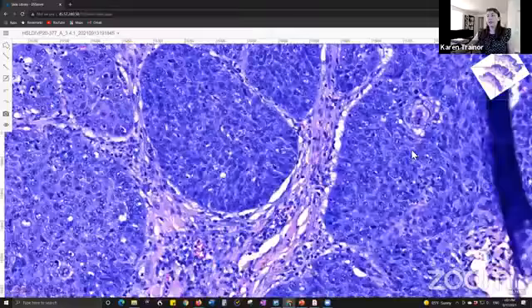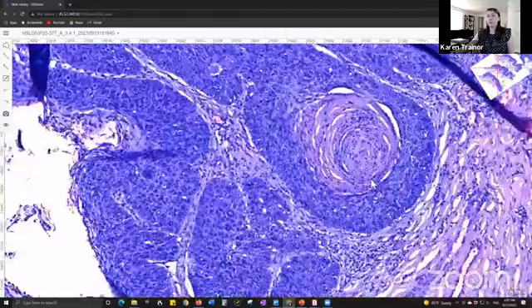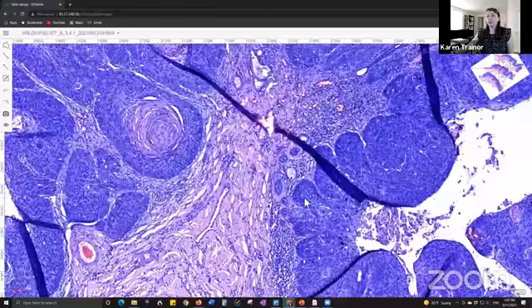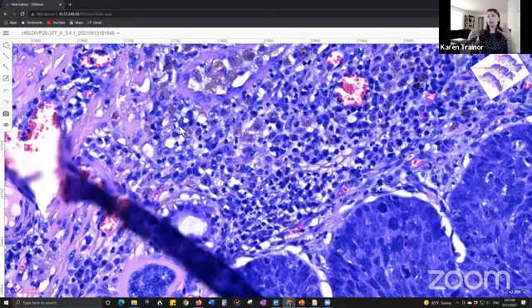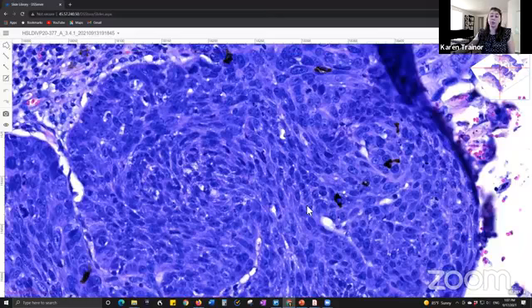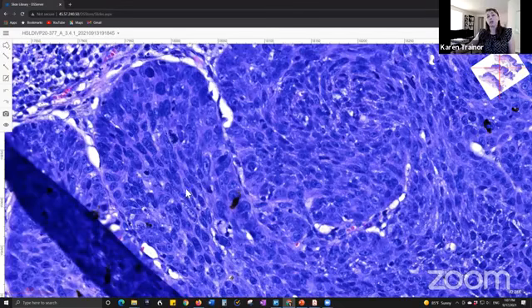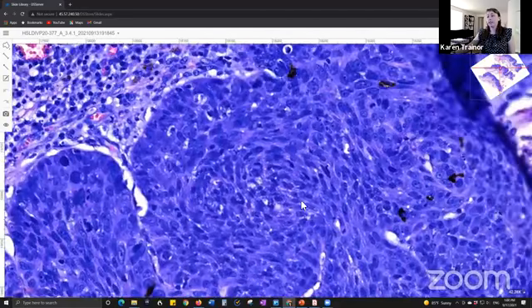It's not uncommon for these to have quite a bit of dermal inflammation as well, and that can be quite variable. Sometimes you get some keratin pearl formation. Here we have a mix of mast cells, lymphocytes, plasma cells, and pigmentary incontinence. Remember how we saw some hyperpigmentation changes as well? That can happen. Sometimes these tumors can be melanized. This is not uncommon with follicular tumors as well, and some sebaceous masses, especially when they occur on the eyelids, so meibomian tumors. You can see all of the mitotic figures. So melanized variants of this are possible as well.